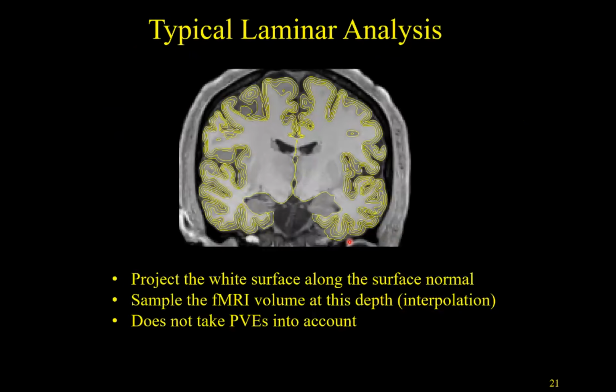So that's the basics for this idea of the spatial GLM. So how does it apply to a laminar analysis? When I wrote the FreeSurfer functional analysis stream, I actually had the ability to do layer analysis, back 20 years ago, whenever I developed it.